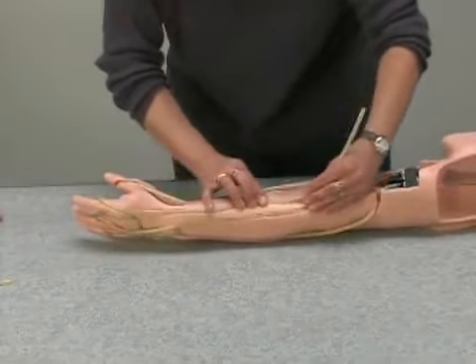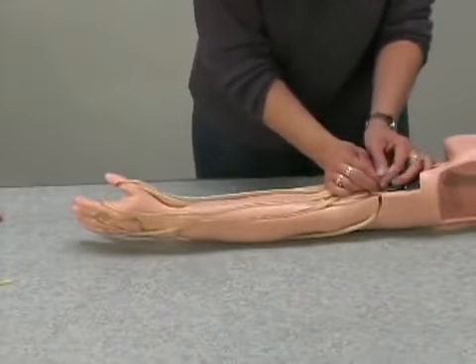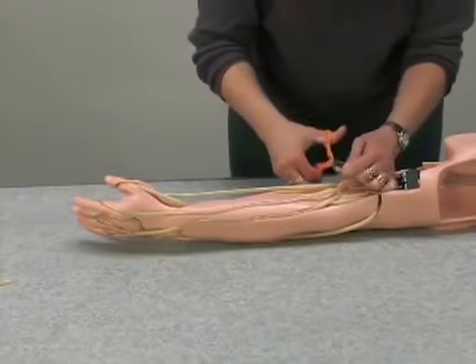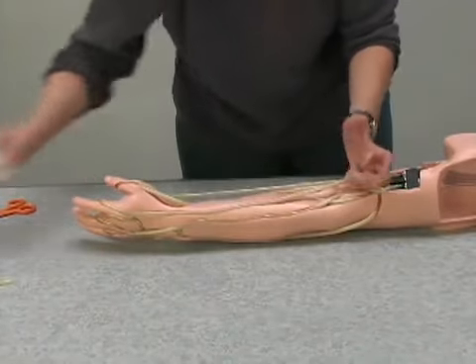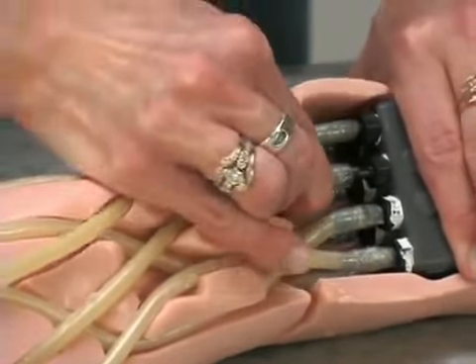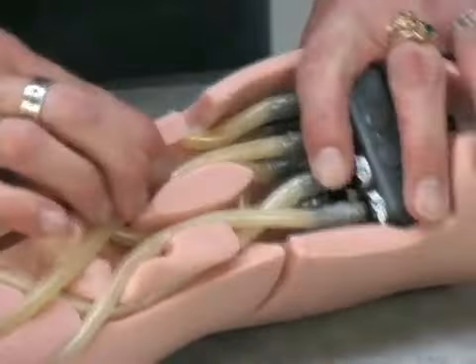Run the vein under the first tubing and over the length of the next set. Lubricate the end of the vein and connect to fitting number 8. Check that all fitting connections are tight to prevent leakage.